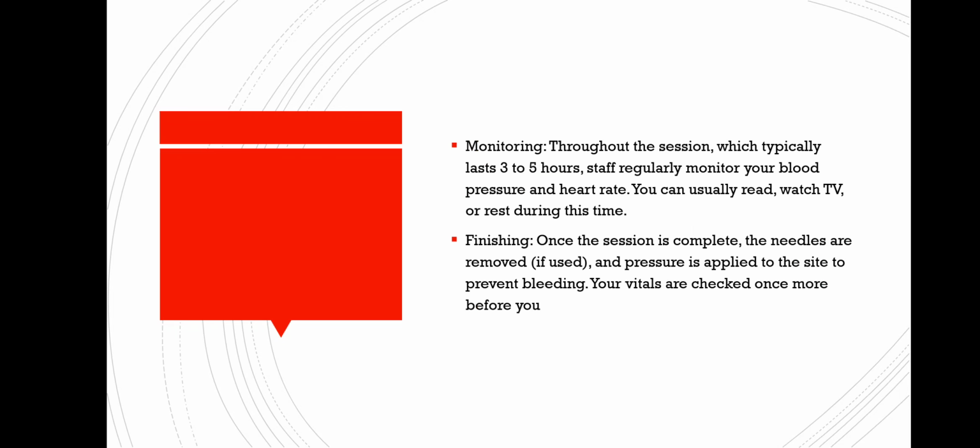Next, monitoring and finishing. Monitoring: throughout the session, which typically lasts 3 to 5 hours, staff regularly monitor your blood pressure and heart rate. You can usually read, watch TV or rest during this time. Last, finishing. Once the session is complete, the needles are removed if used and pressure is applied to the site to prevent bleeding. Your vitals are checked once more.